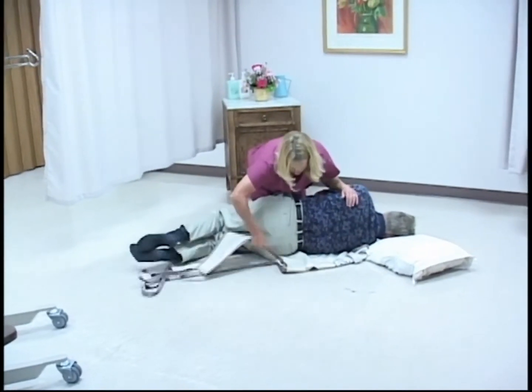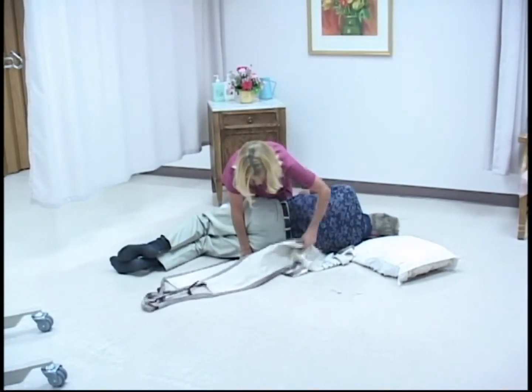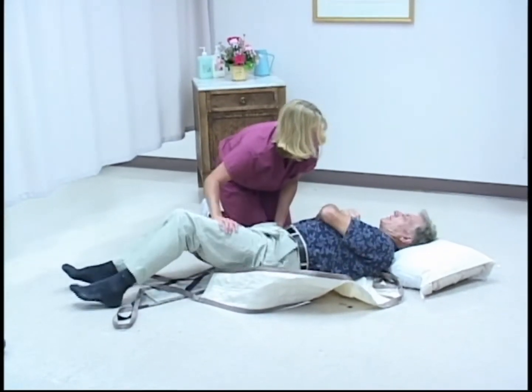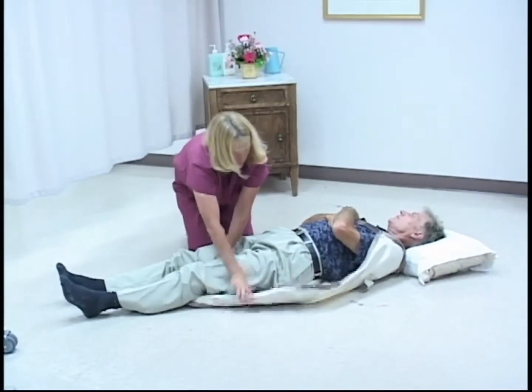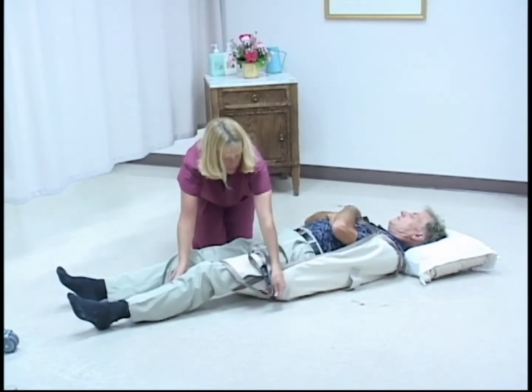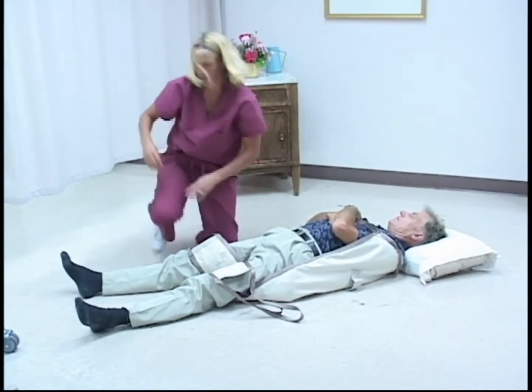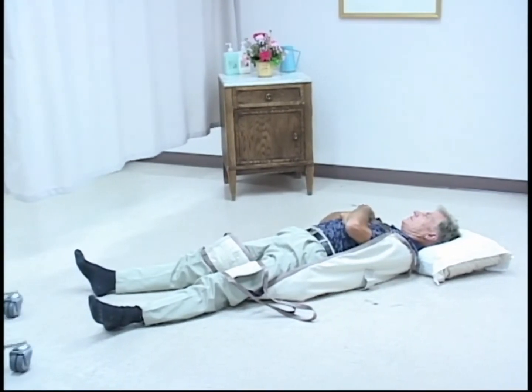Using the center handle as a guide, center the sling on the patient's spine with the opening of the sling even with the base of the tailbone. Make sure the sling is centered underneath the patient. Lift the patient's right thigh and pull the right wing of the sling under the patient's thigh. Repeat this step on the left thigh. When you are completed, put the straps on the patient's chest. The patient is now ready to be lifted.